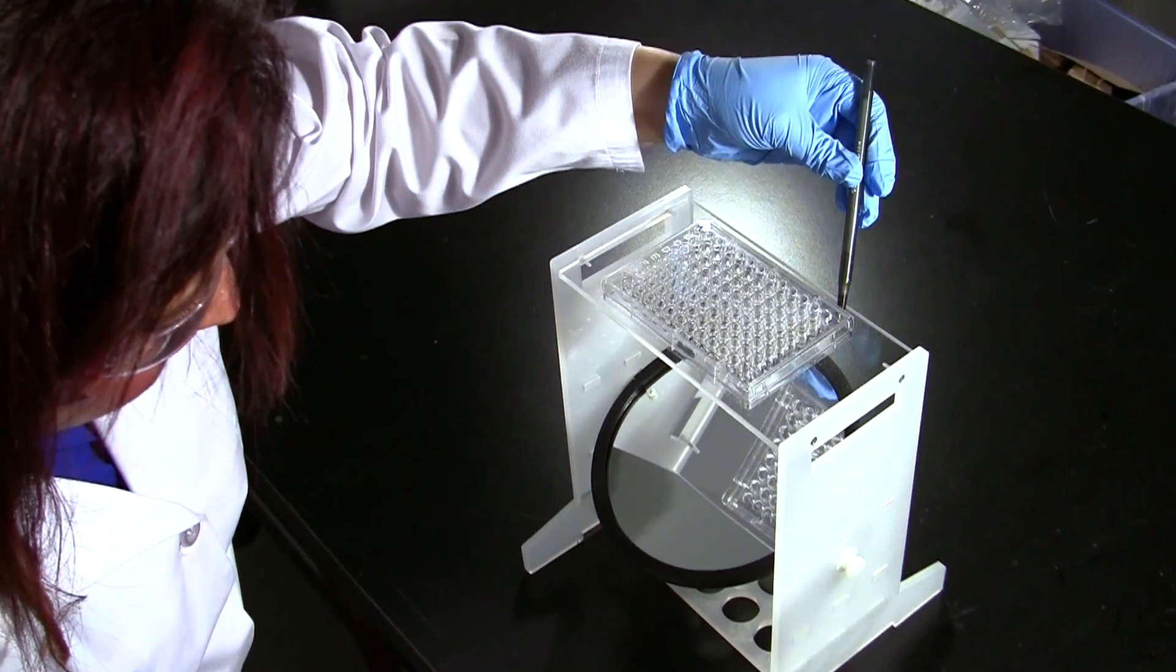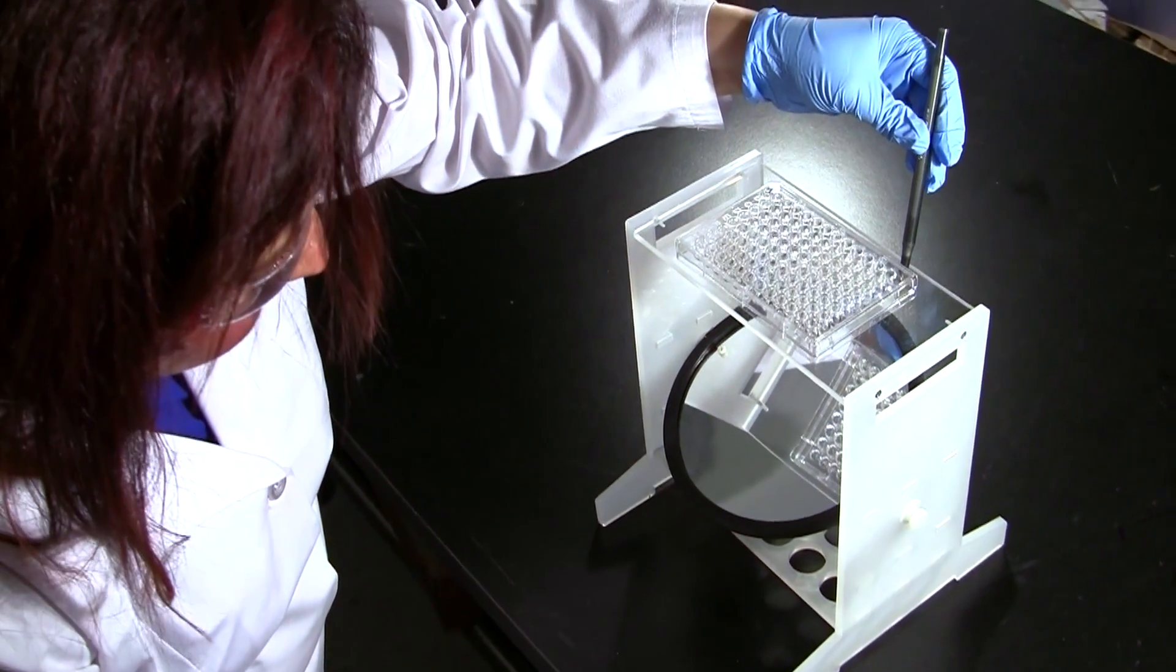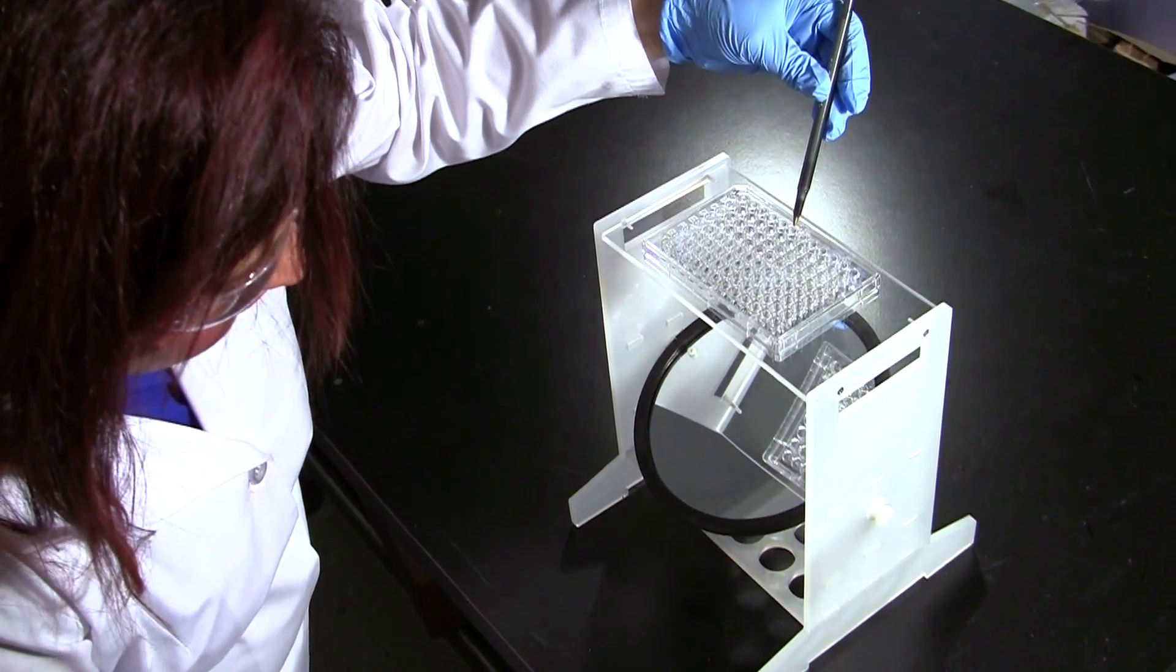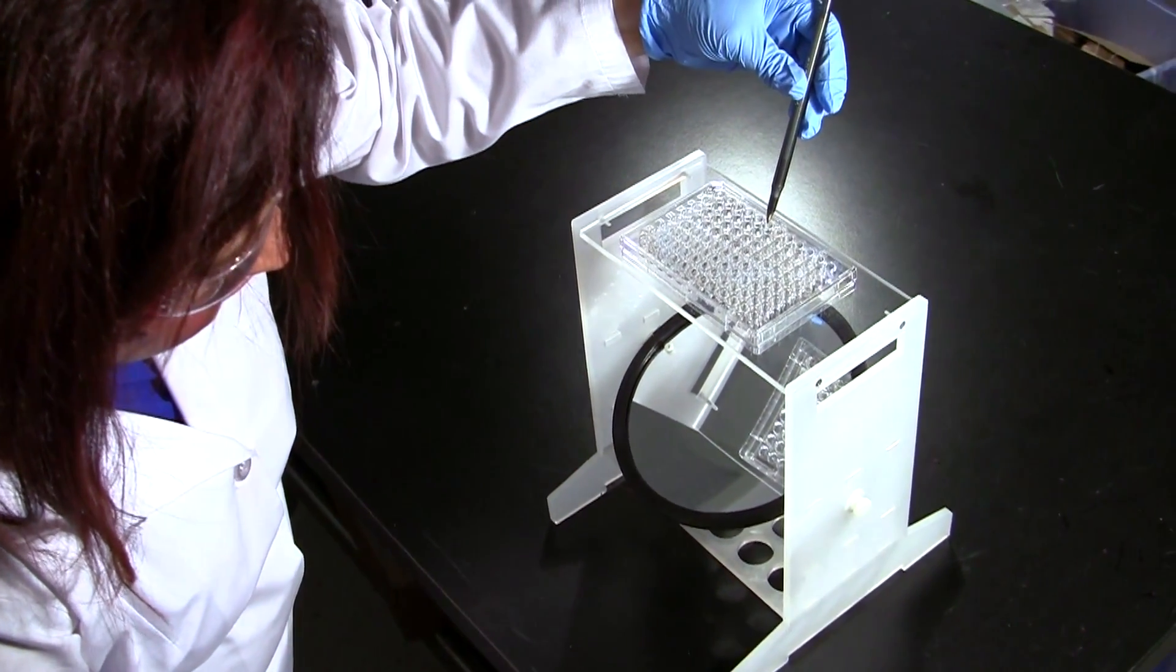As you can see, column 12 is the growth control where you see turbidity, whereas column number 6 is actually the MIC for this compound because this is a clear well and has no growth.